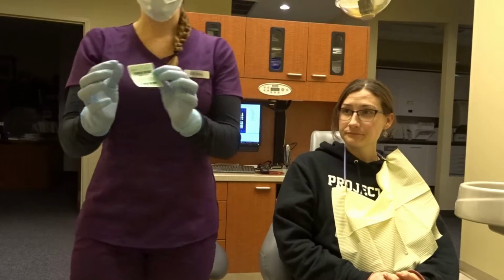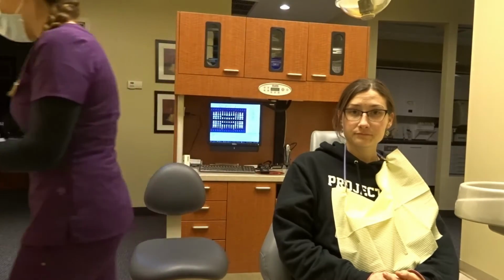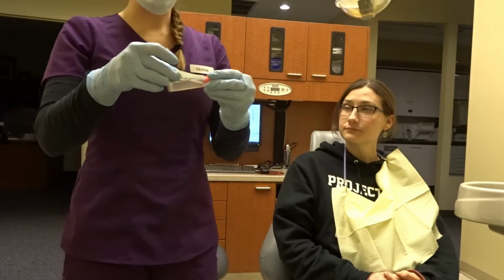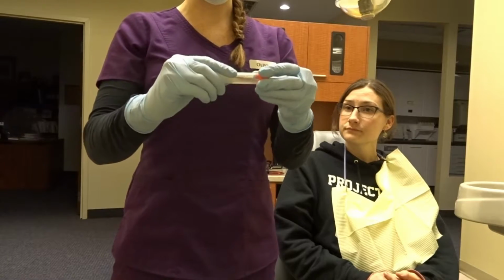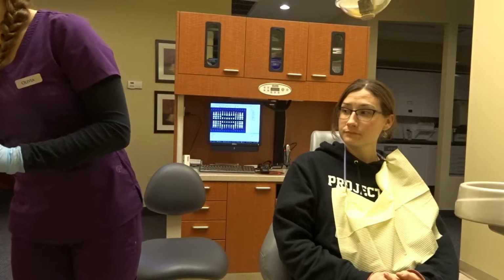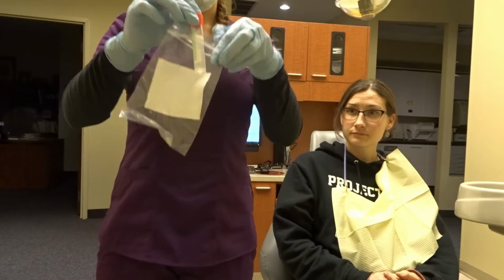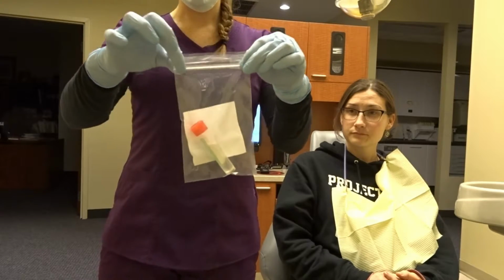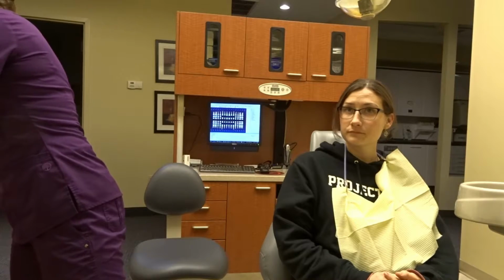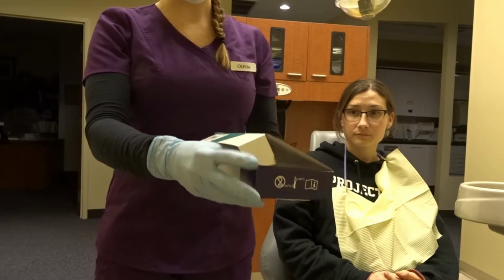The patient's name and date of birth will be written on this sticker here. It will be placed onto this tube here. The tube is then put into this bag here, and it is packaged back into this box and closed.